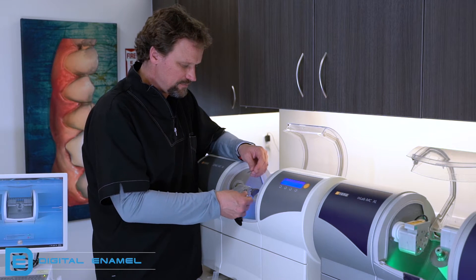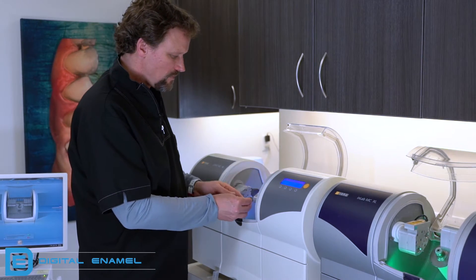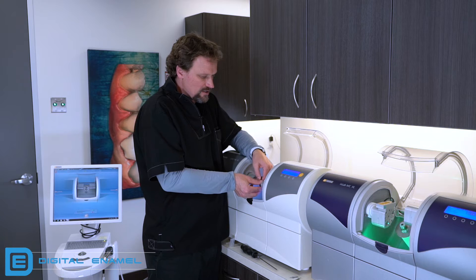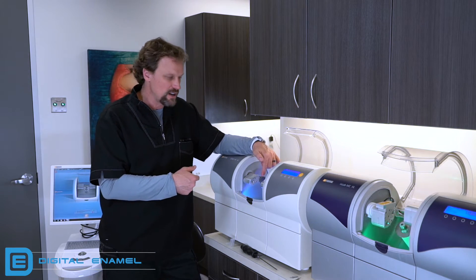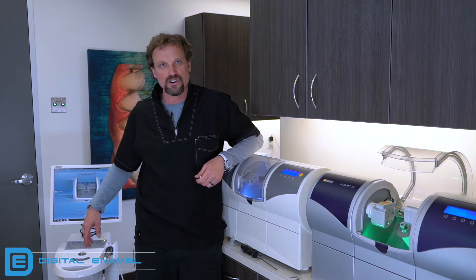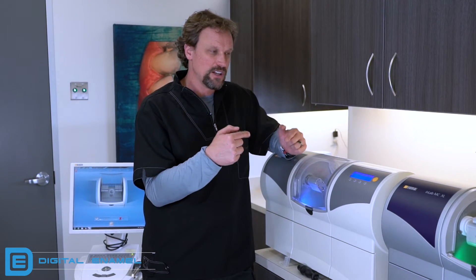Torque the calibration pin into place. It's okay to hear the little crack of the torque wrench — you want to hear that so that it's torqued properly. If there's any doubt whether you torqued it into place, just do it again, because the torque wrench won't allow it to be tighter than it needs to be. So we have the calibration body in and the two calibration pins in place. Always shut the door, then you can hit start on your MCXL or go back to the software and hit start there. The calibration pins are going to go into that calibration body and touch it in very specific locations to make sure everything is set up.